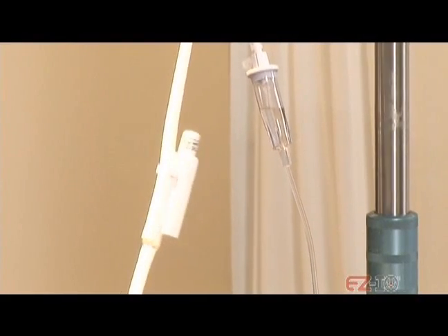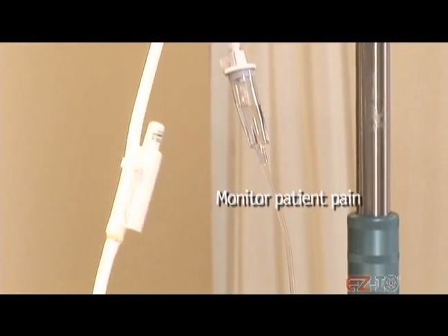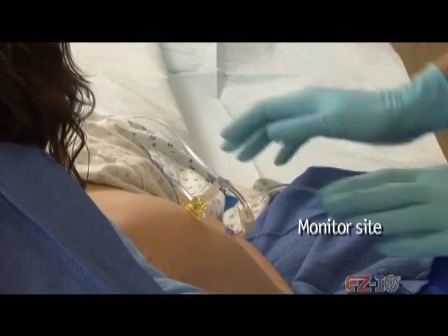Still doing okay? Yeah, it's a little pressure, but it's tolerable. Okay, great. Monitor the patient's pain during infusion and repeat lidocaine as necessary. All right, there we go. Monitor the infusion site for signs of extravasation.